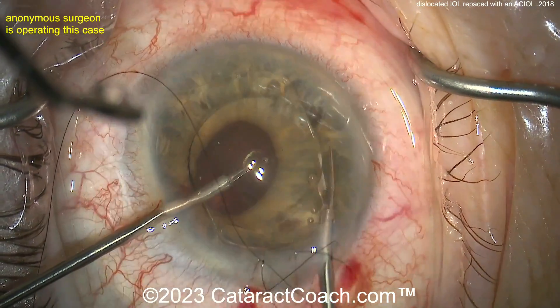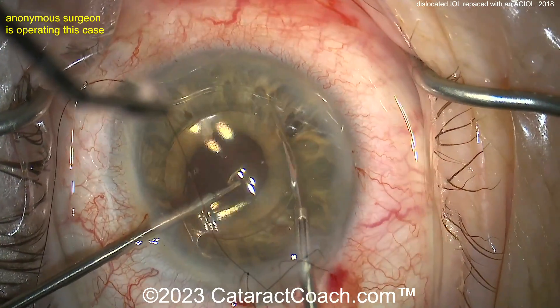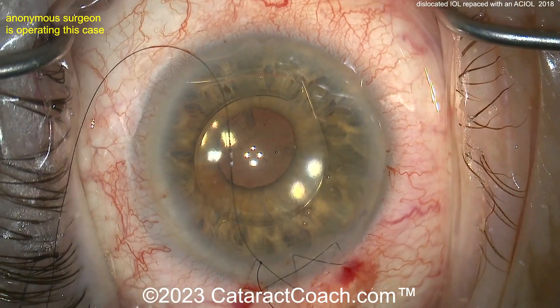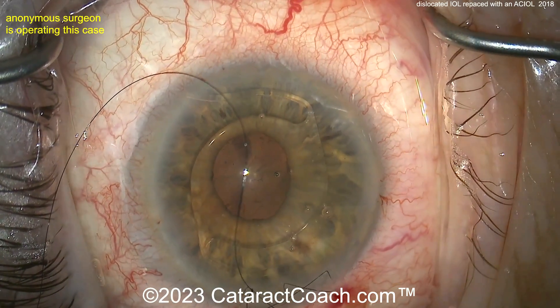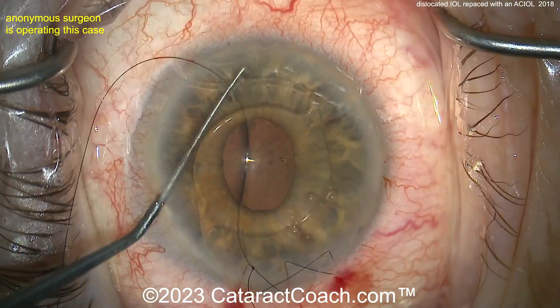You definitely need to make a peripheral iridotomy. There's a small PI being done, and the reason is that the optic overlaps and covers up the pupil, so you may not get sufficient flow. There you go — good PI, definitely patent and open. Now suturing up the main incision.